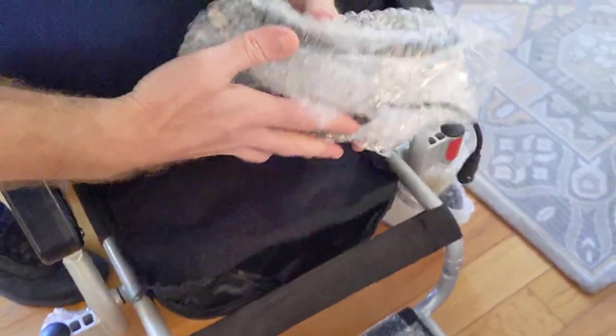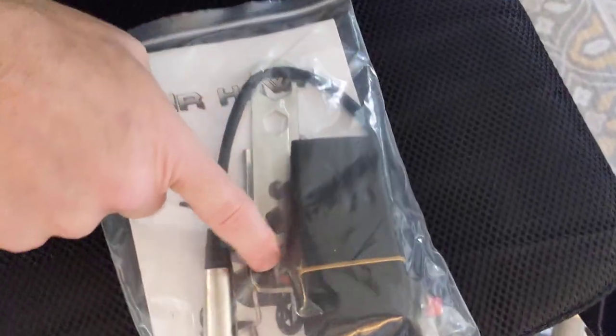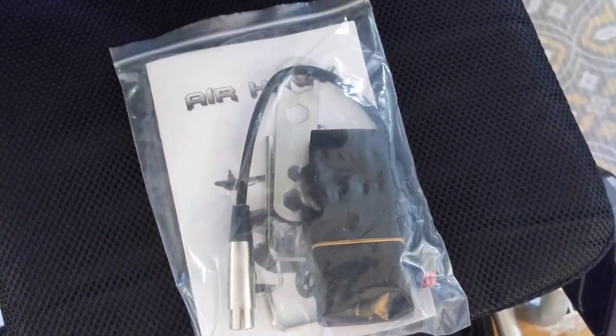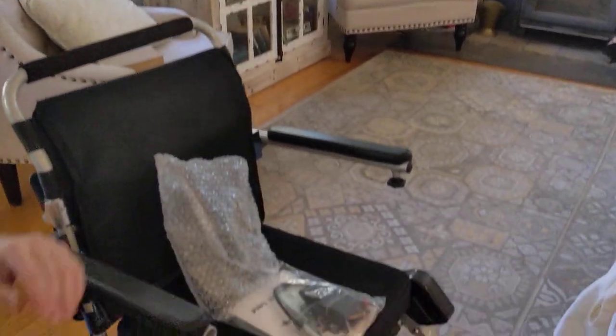Now we just need to look at the basket underneath the chair. Get this basket opened up and lo and behold — we have the seat belt, a couple of allen wrenches, what's called a pigtail attachment right here that plugs into the charger and will charge one battery outside of the chair, and we have the joystick itself.